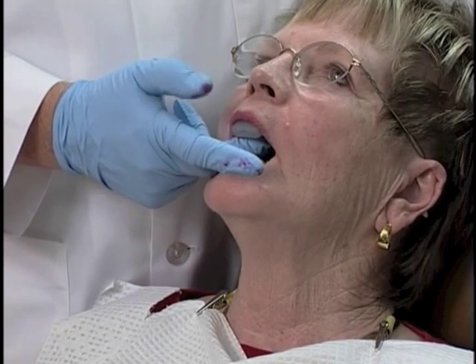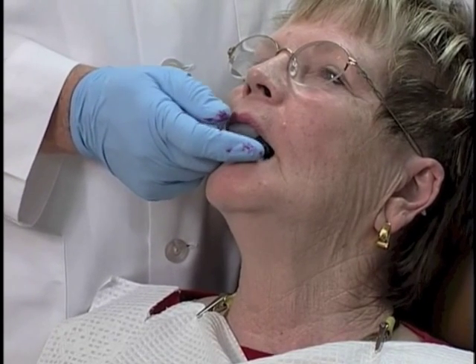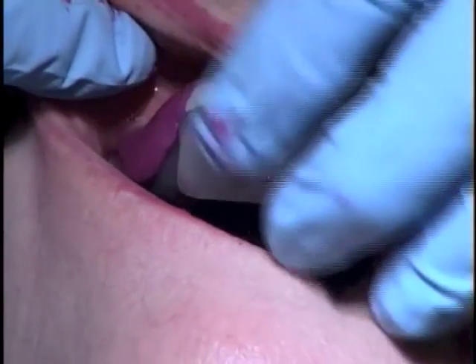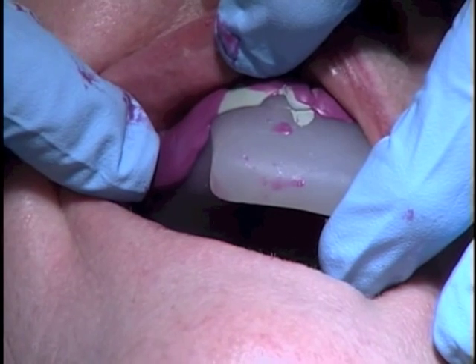And we can allow that to just relax, allow that material to set all the way. It usually takes 3 to 4 minutes for the material to set. Another way of checking for the set of the material is to lift the lip and take a fingernail and poke the material. And if it rebounds all the way, the material is set.